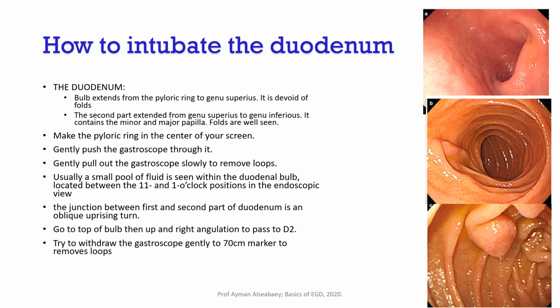Just do torque clockwise and pull out the endoscope with gradual suction of air. When you get inside the bulb, it will spread out because you will be against this area. Just pull a few millimeters and inject air.